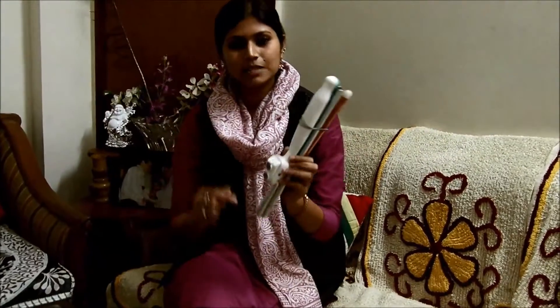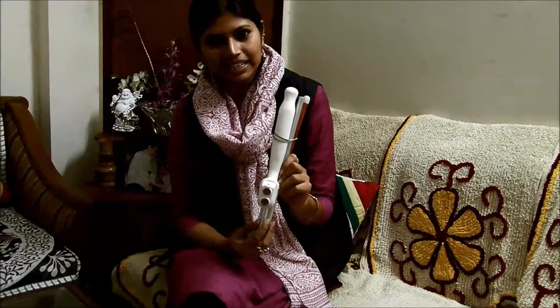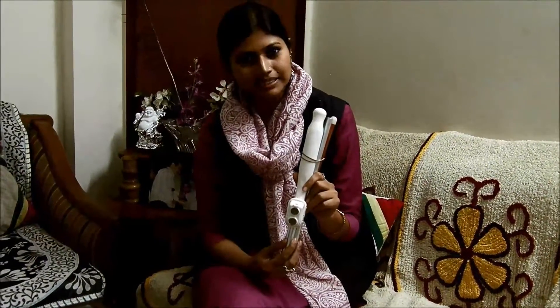This device, the SmartKin device, has been jointly developed by IIT Delhi, Saksham Trust and Phoenix Medical Systems.